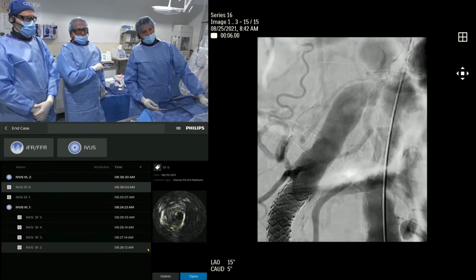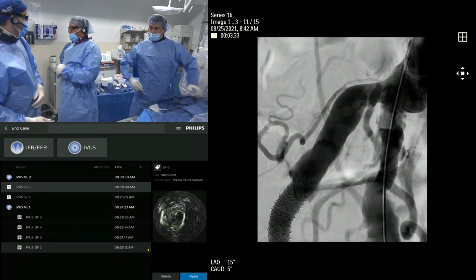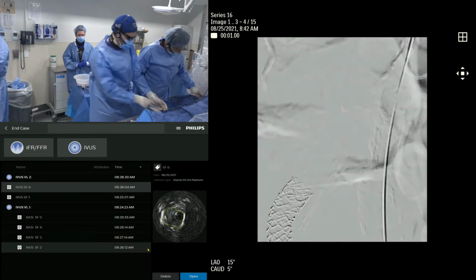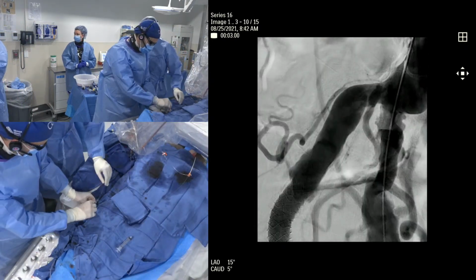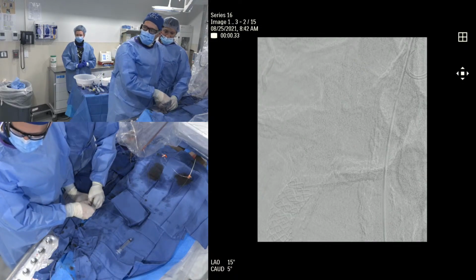So the other thing, Raman, and maybe Luke can expand on this a little bit. Luke, can you tell us what makes the VBX stent a little special for us? So what size VBXs do we have? Go ahead, Luke. What do you got? You're live. What is the difference between VBX and other covered stents?